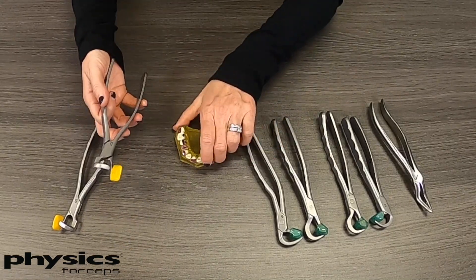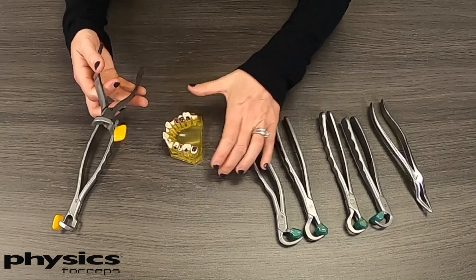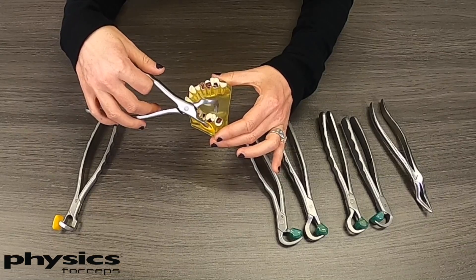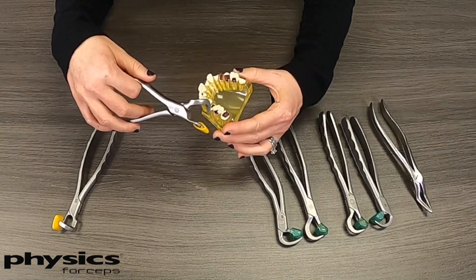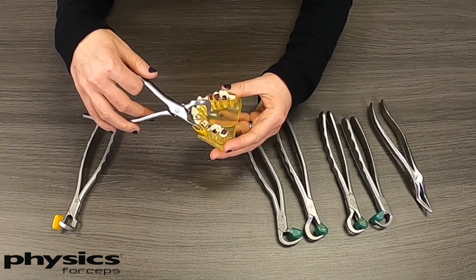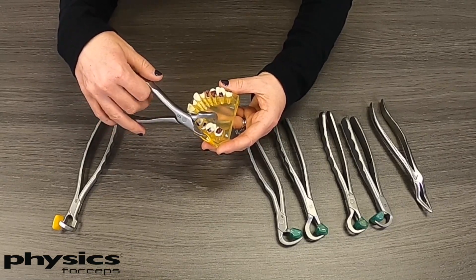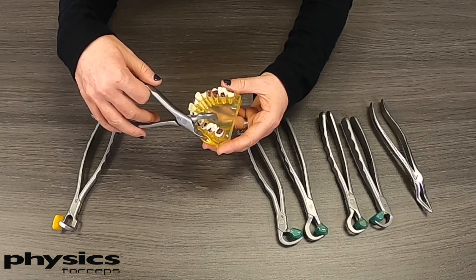We also have these two instruments here — the molar series. Basically, how these work is they come in from the front of the patient's mouth, not the side. So when you have limitations from the patient's cheek or they don't open very wide, these will be able to sneak in there easily and do exactly the same thing.